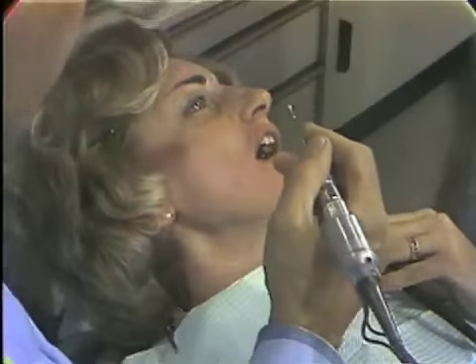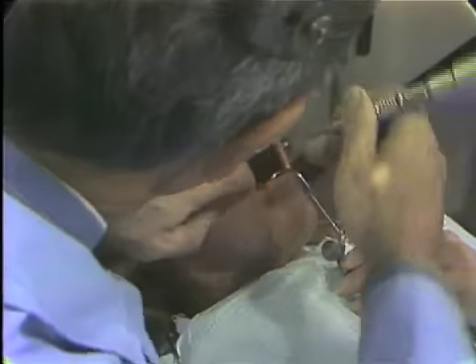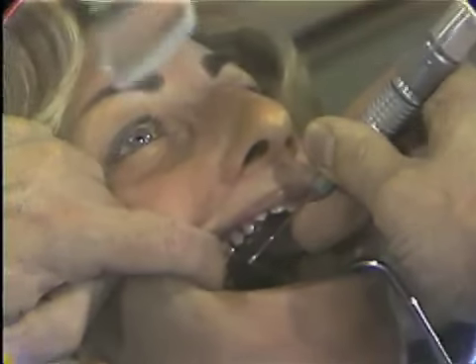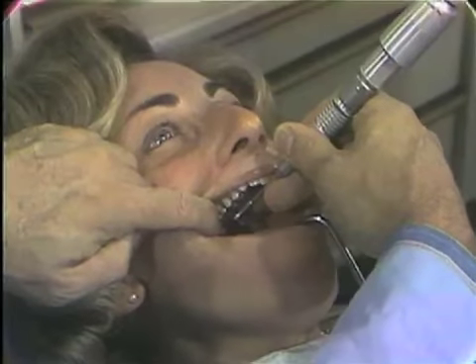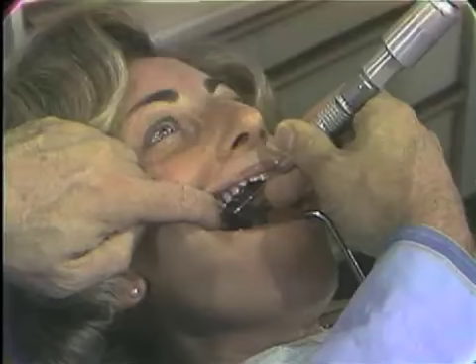That is taken care of the buccal for us. Now, bring the patient back slightly towards you, and then still in the same position, you come in and resting now probably back on the bicuspid, you will come in and directly look, and you can see that I have my disc now in the mouth. Position of the disc is such that I can determine the taper because I'm looking between the tooth and the disc. Now also notice why we are using the 2.5 inch mandrel.